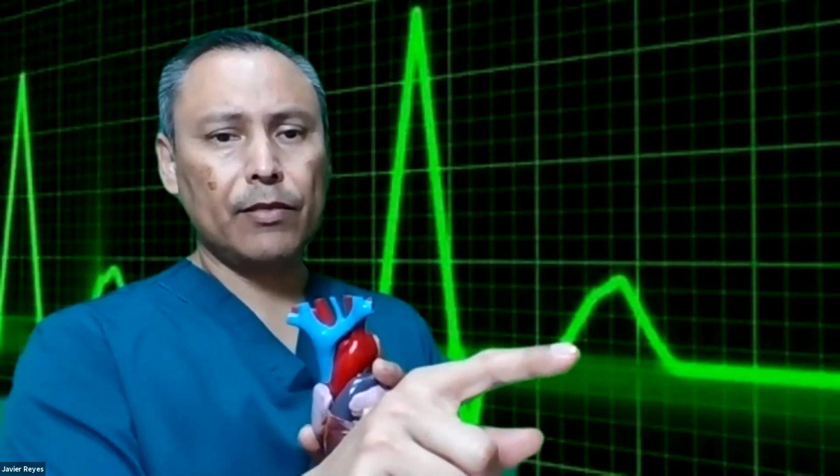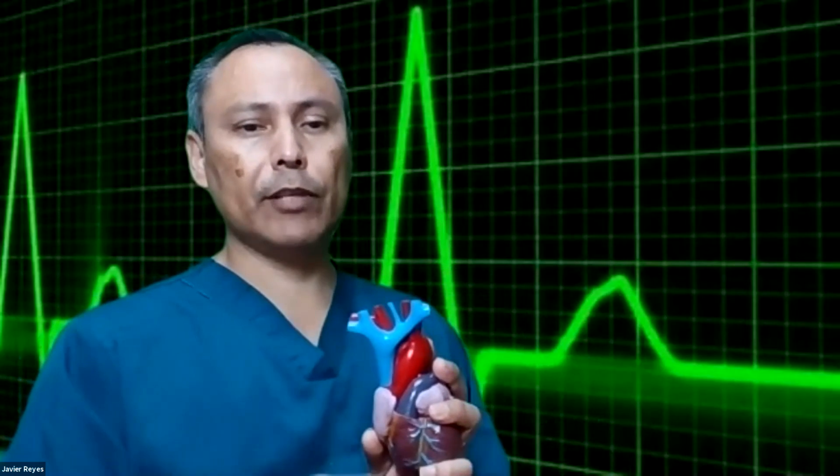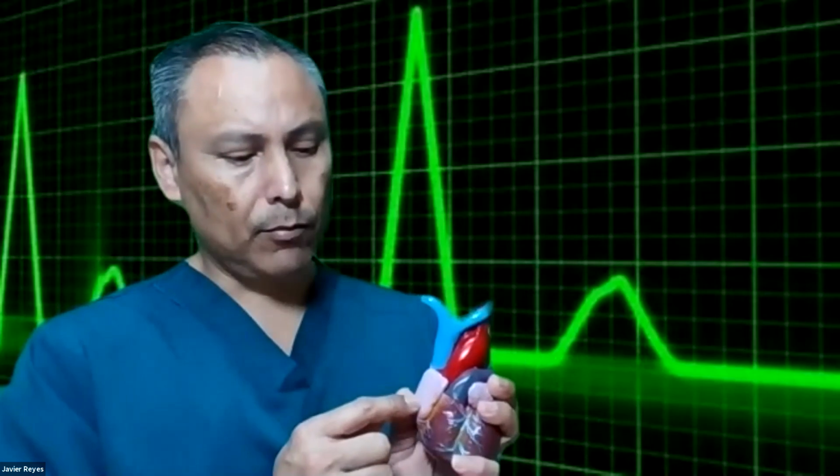So what's going to happen when there's a first degree block? This from here to here is going to be longer. Got it? So that is what you're going to be looking at, the PR interval. That is why it's one of the 5 criteria that we have to evaluate, because that's where things can also go wrong. So somewhere around here in your atria, the impulse is being slowed down by what? It could be many things.